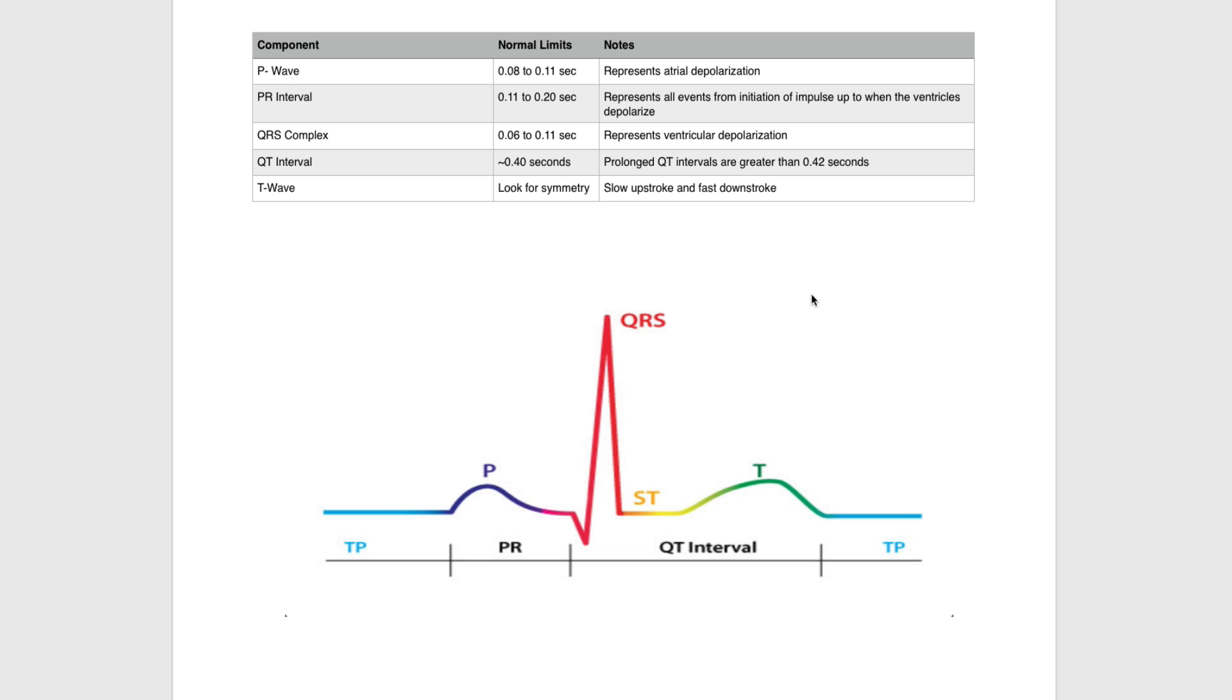Next is the T-wave, shown here in this greenish-yellow line that ends when it turns blue. With the T-wave we look for symmetry: a slow upstroke followed by a fast downstroke.